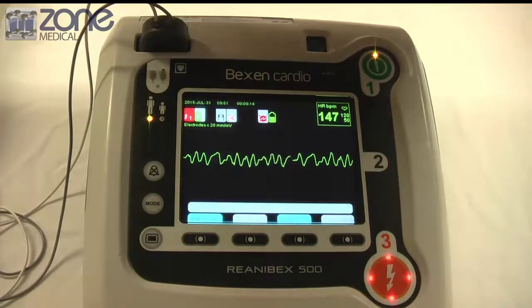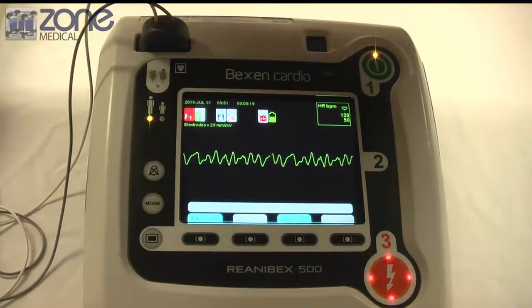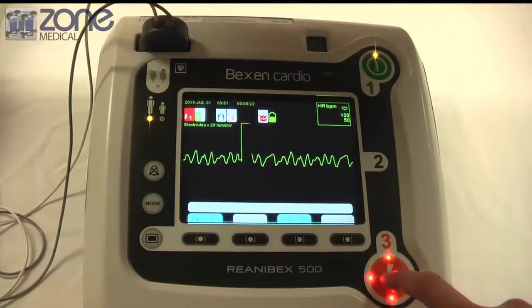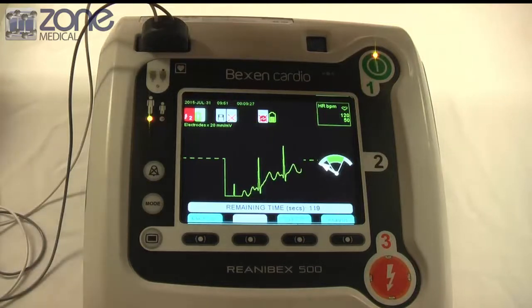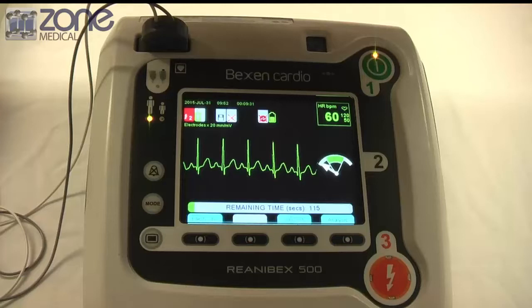Do not touch patients. Press flashing button to deliver shock. Begin cardiopulmonary resuscitation. Keep time with the beat.